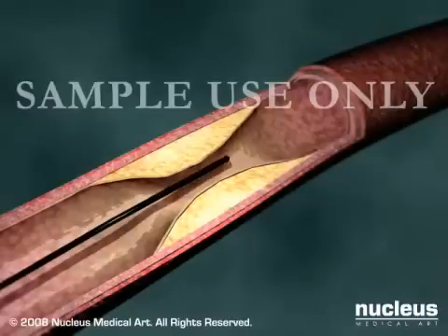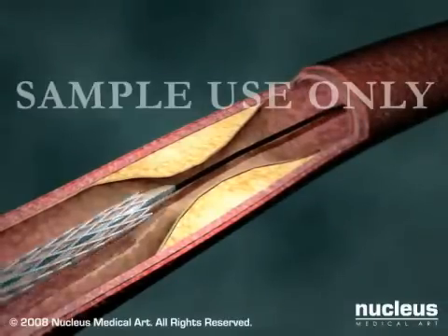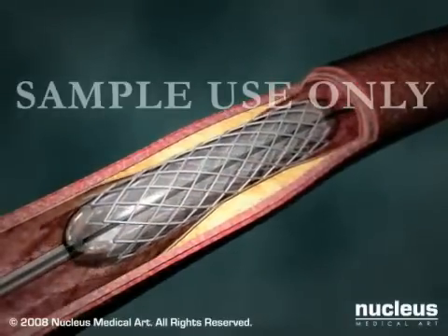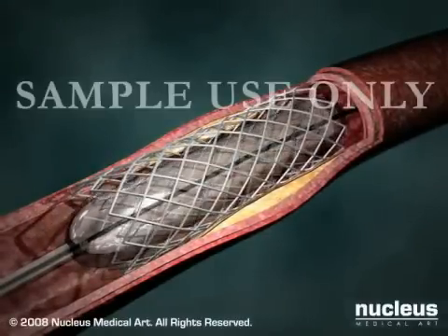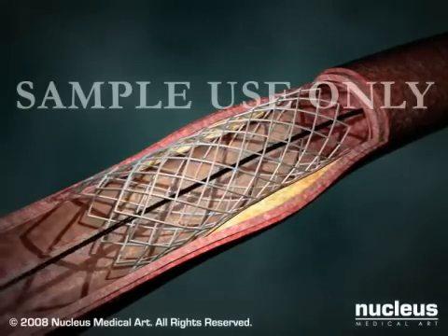Some patients will receive a coronary stent, which is a small tube made of wire mesh designed to prop open the artery once it has been treated. A collapsed stent is placed over the deflated balloon as it's moved into position. When the balloon is inflated, the stent expands and locks into place. After the balloon and catheter are withdrawn, the stent remains behind to hold the artery open permanently.